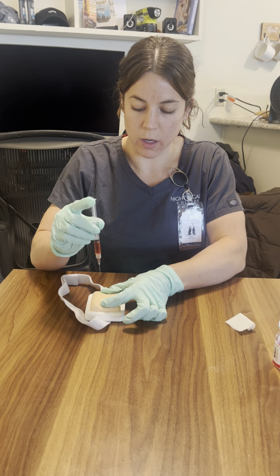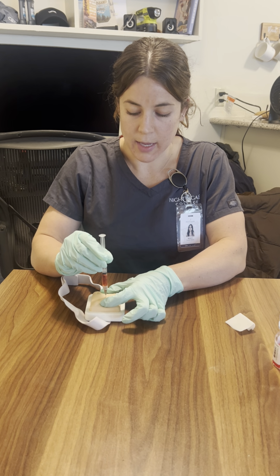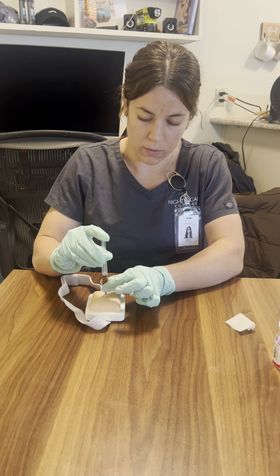Intramuscular injections are going to go in at 90 degrees. So I'm going to press in. I can let go of the skin now to support the needle, and I'm going to inject nice and slow. About every 10 seconds, we're going to do a milliliter.